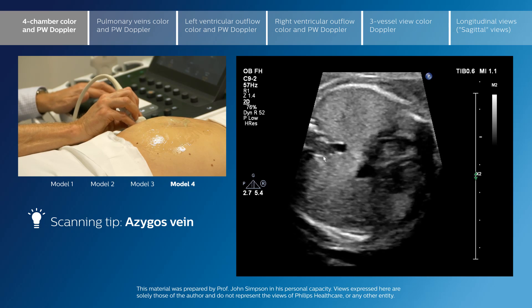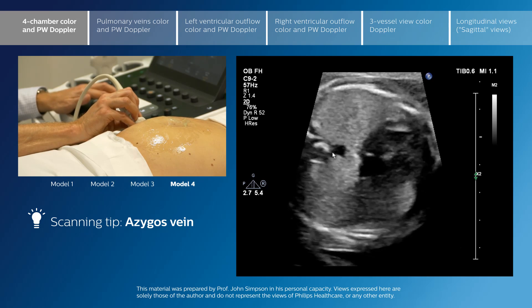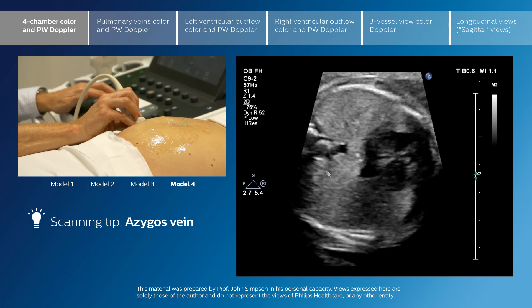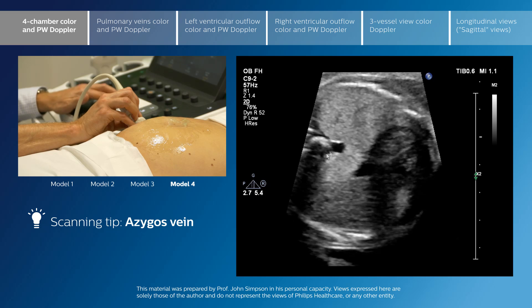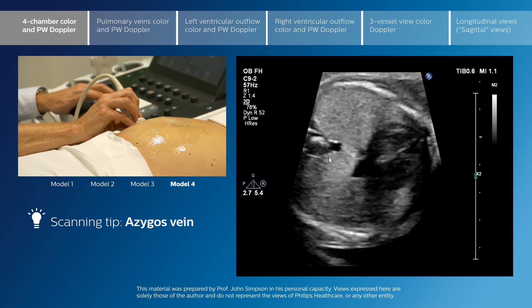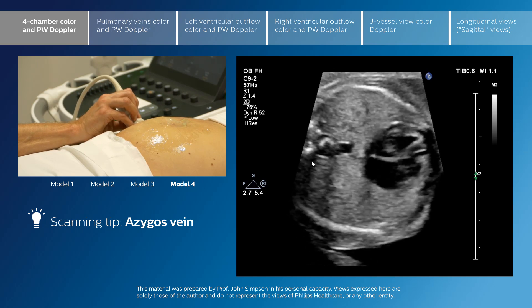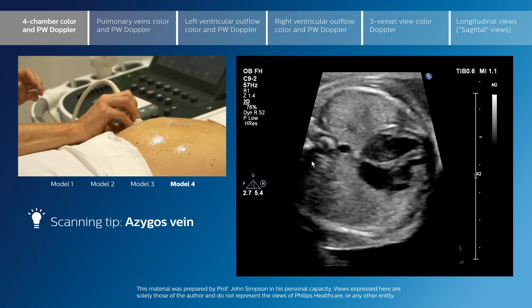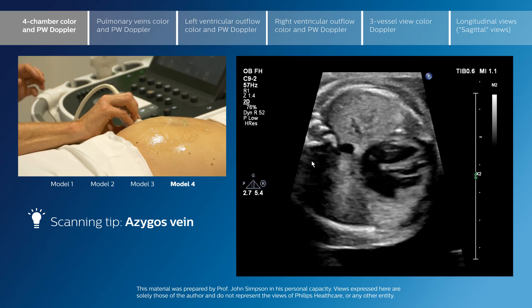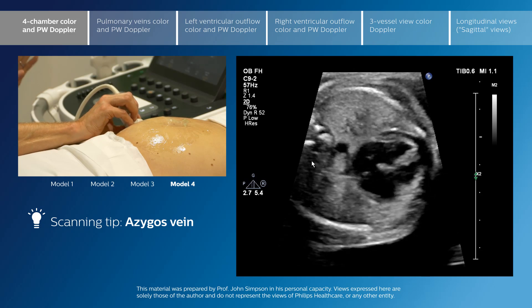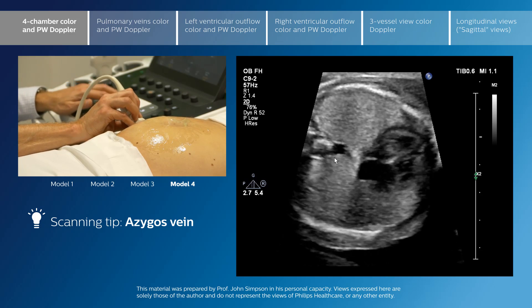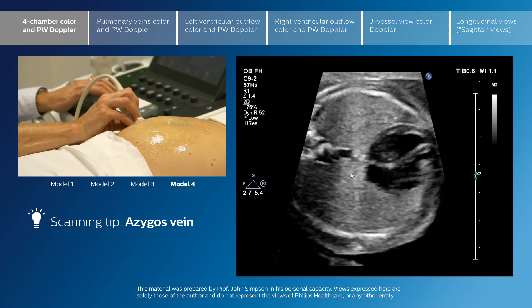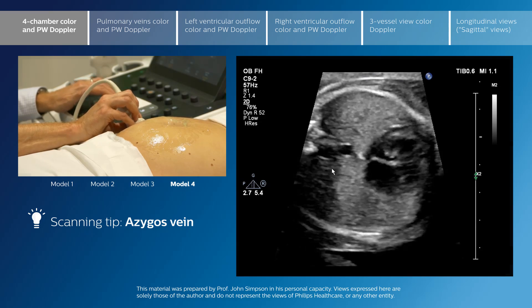If you see a vessel sitting in this position which is as big as the descending aorta or almost as big, it would make you suspicious that the inferior vena cava may be interrupted and that flow above the diaphragm may be via the azygous vein.